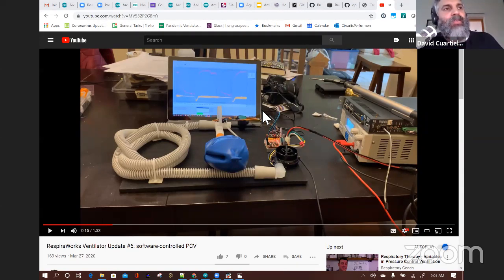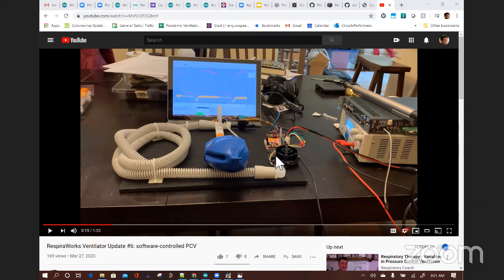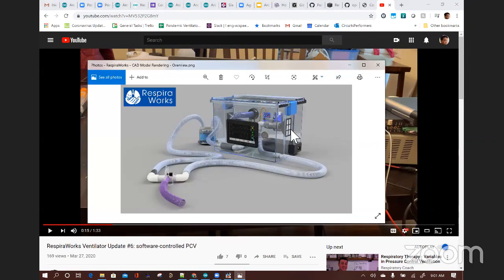Okay, great. And there are two more questions, and then we close this panel because otherwise we run out of time. So is there a filter for the air? And if so, where? There will be an inlet and outlet HEPA filter. So this is more visible in this design where you can see the filters. Okay, thanks. And we'll begin building this next week.